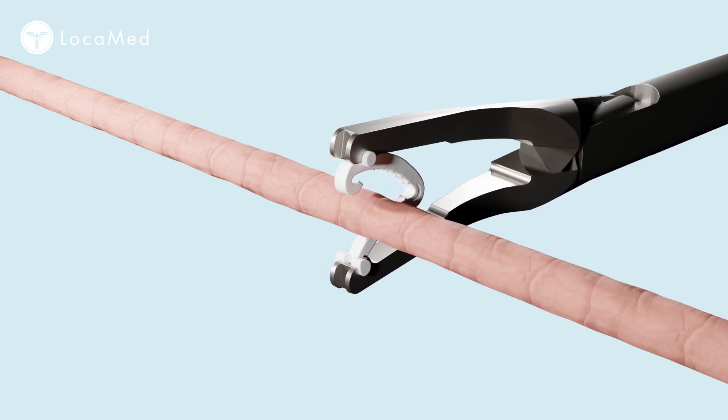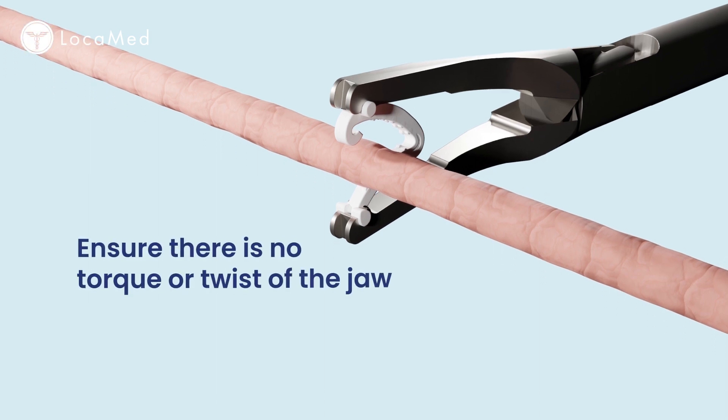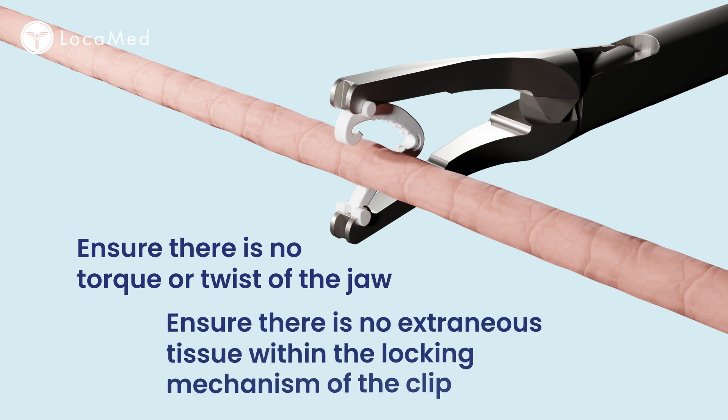Rotate the applier jaws so you are able to see that the vessel fits completely within the confines of the clip. Otherwise, hemostasis may be compromised. No torque or twist of the jaw is allowed during clip deployment, and ensure that there is no extraneous tissue within the locking mechanism of the clip.